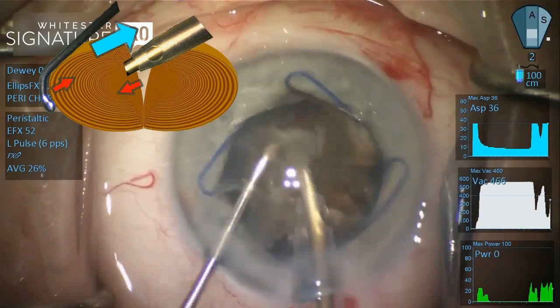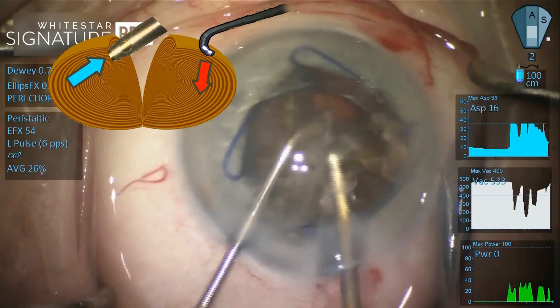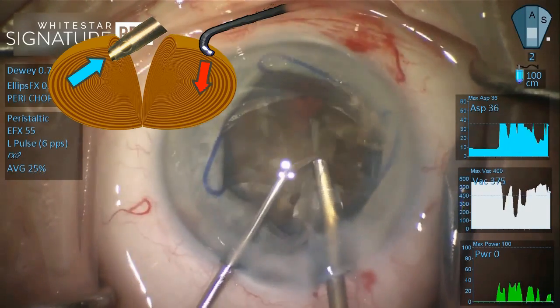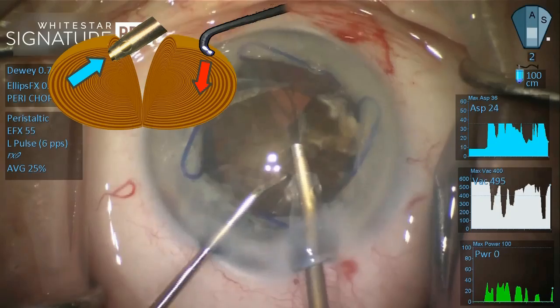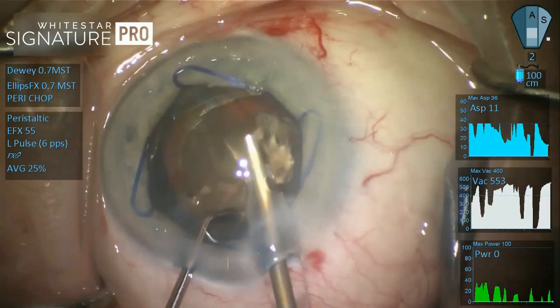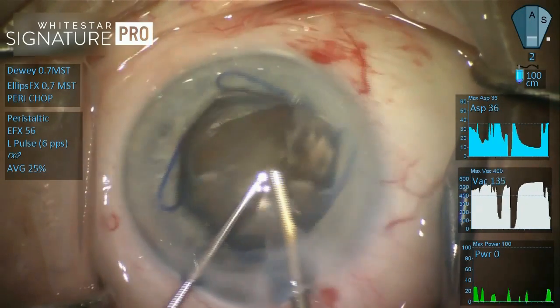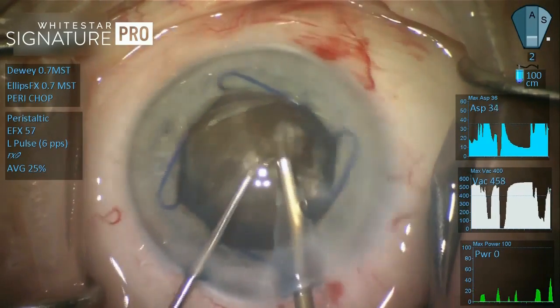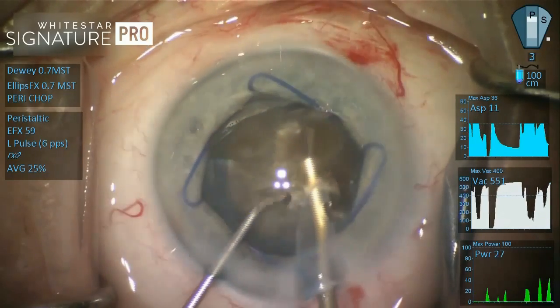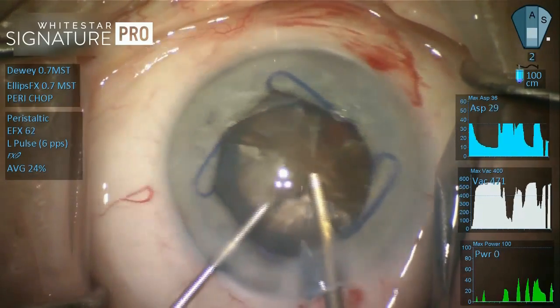And what I realized as I'm watching this case is that I'm using vacuum to essentially impale the nuclear material, but I'm using the chopper to hold the material stable, because the vacuum is really doing the majority of the work. So as we watch the high levels of vacuum, again up to 550 millimeters of mercury vacuum, we are seeing very low delivery of power. There is no 100% power. Now that's my maximum, but there we saw a little burst at 15.